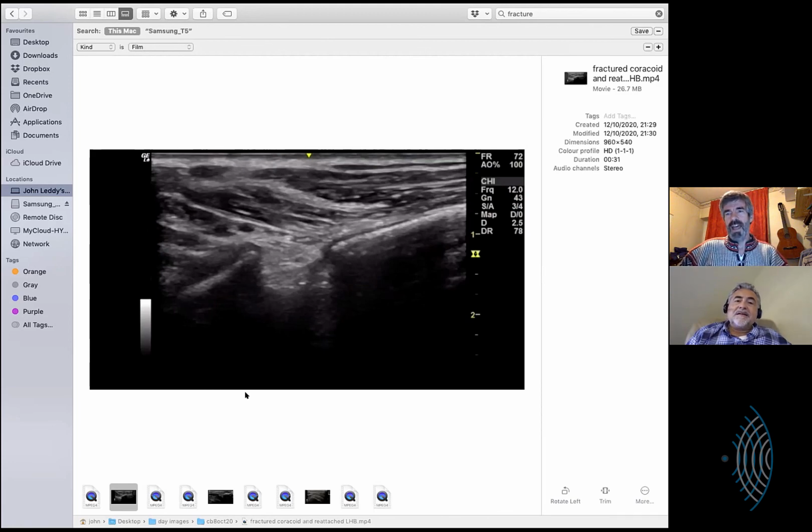There's a huge variation in how it is, which is what my surgeon friends say. A huge variation in how thick they are, normally. Their position is slightly variable. Sometimes it's continuous with the pec minor tendon, so you get quite a lot of difficulty. Even on better scanners, it's a difficult view in a lot of shoulders. There just isn't the space, there isn't the soft tissue there, and it's pretty tricky to see.